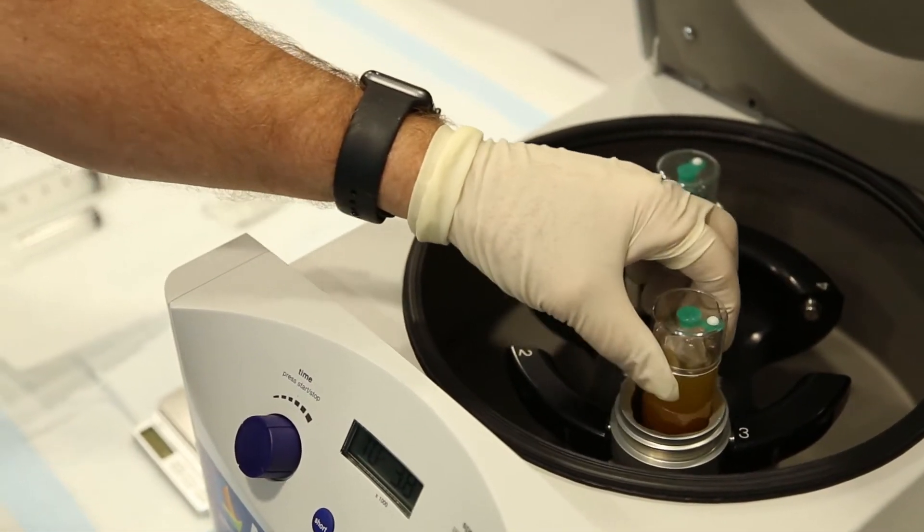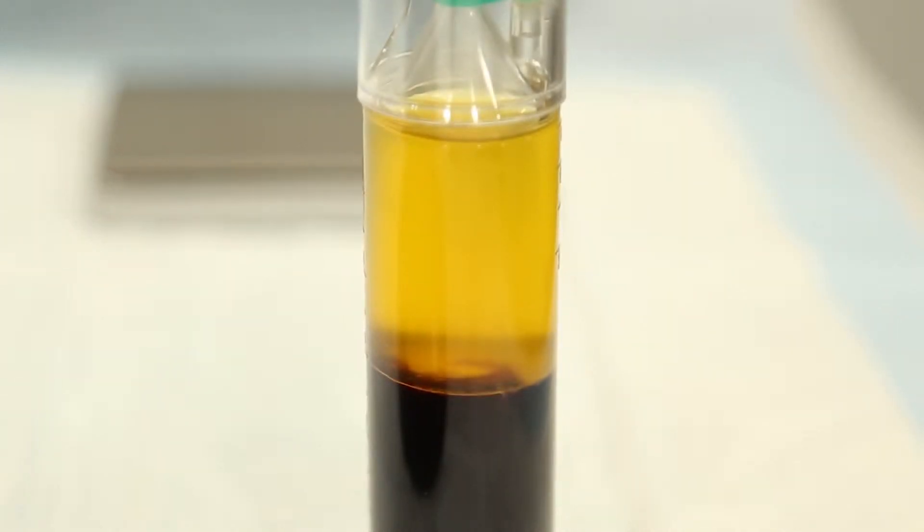After the spin is completed, carefully remove the XL concentrating device from the centrifuge. You should see a clear separation between red blood cells, the buffy coat, and the platelet poor plasma.